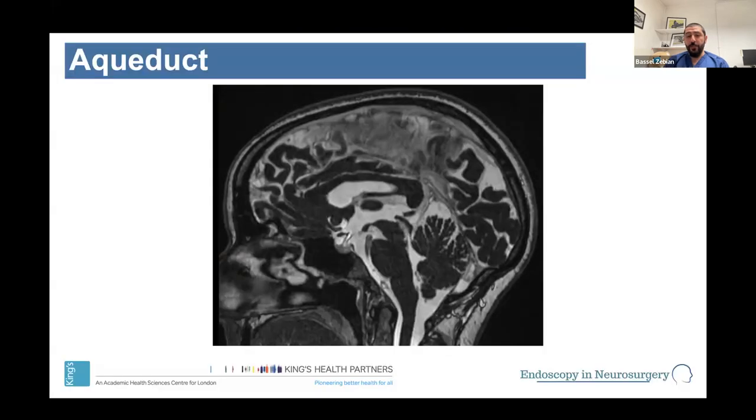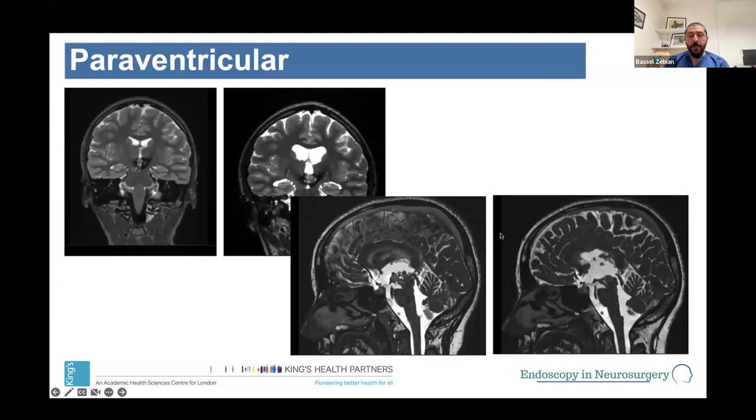It was quite cystic, with some solid components, and we were able to take the majority of that, go in through the aqueduct, take the bit of capsule at the bottom, at the distal aspect, and free it all up. There is a residual, but the midline doesn't really do justice to the residual. Same as Professor Zohidi had shown earlier, some cavernomas.